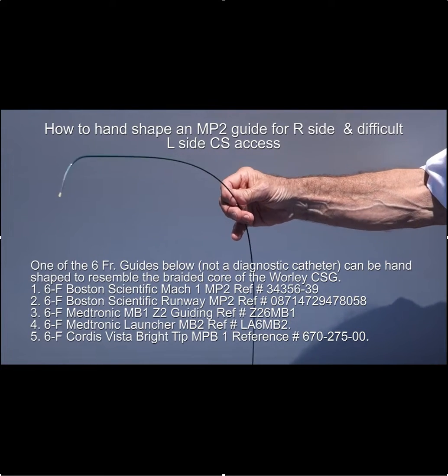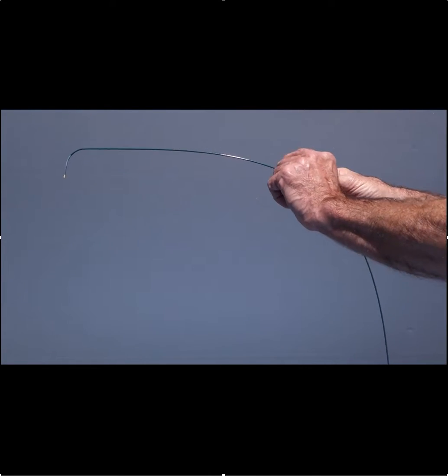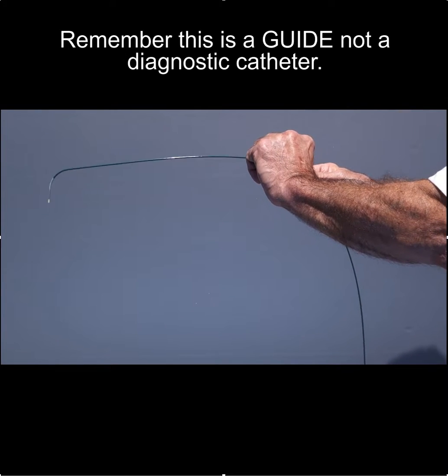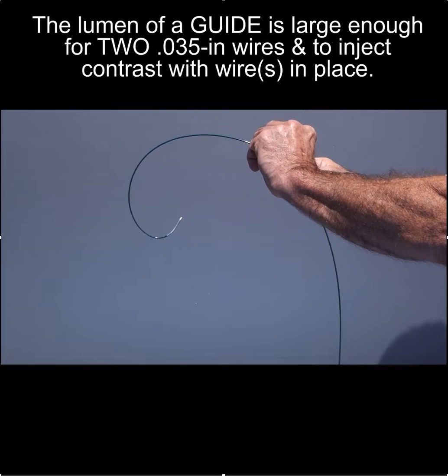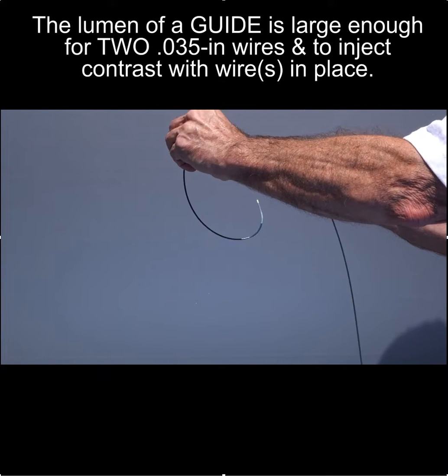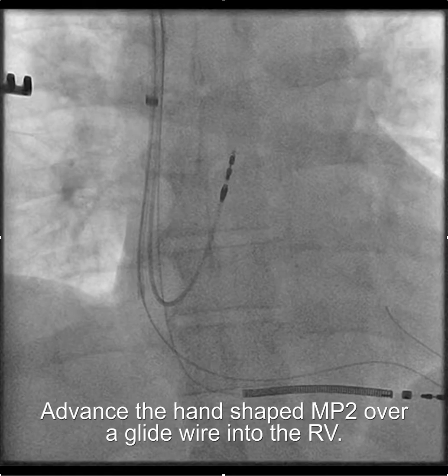The way to shape it is to start way back like this and then go forward. Remember, this is a guide, not a diagnostic catheter. The lumen of a guide is large enough for 0.035-inch wires and to inject contrast with the wires in place, which is very important.